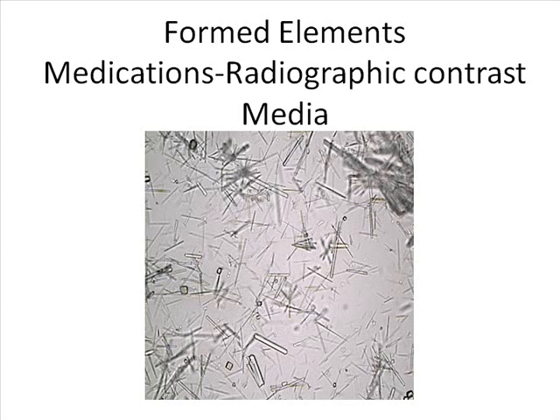Now your radiographic dye, you could see here, boy, it just looks like a bunch of sticks in the urine. And if you look at it microscopically, you're going to go, what the heck are those crystals? In this particular case, I would report out unidentifiable crystal, many, and many times that then goes along with the fact that this is the radiographic dye.